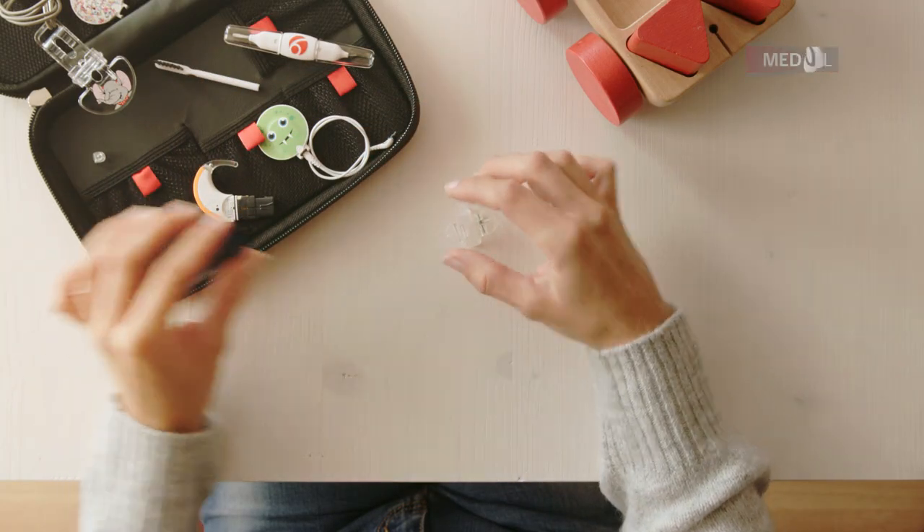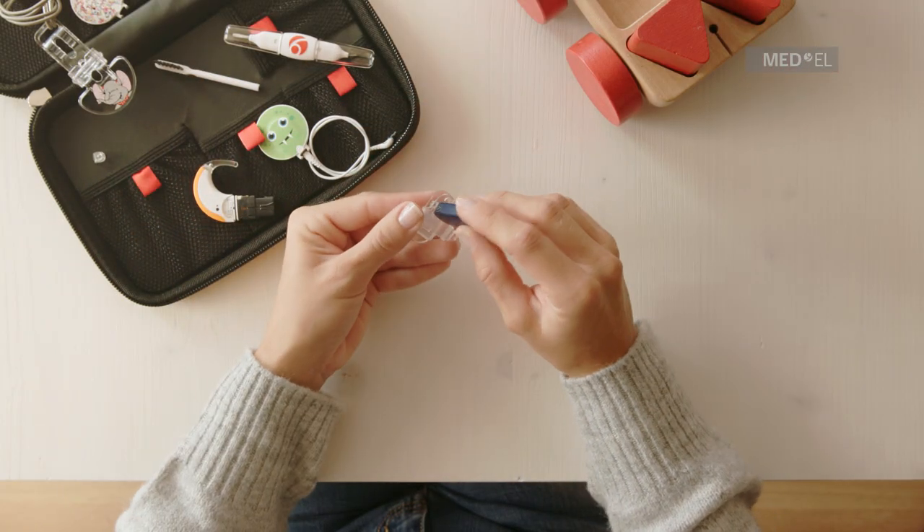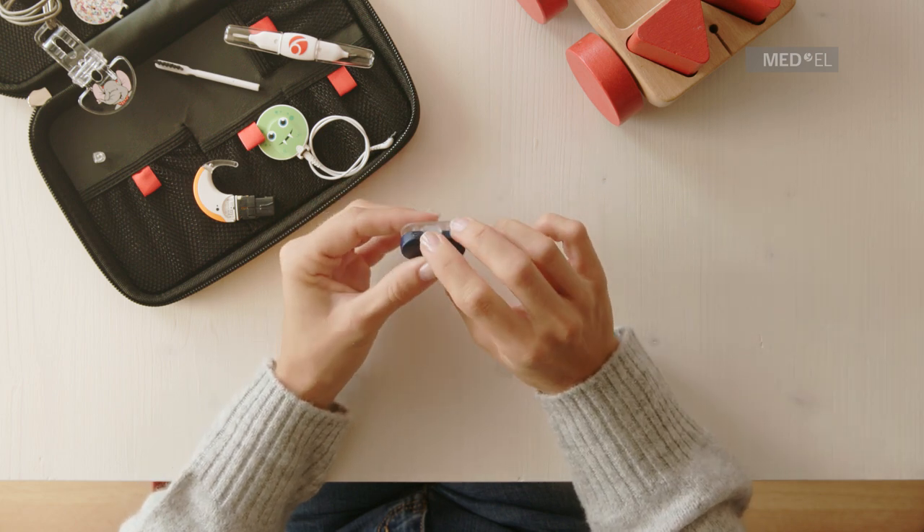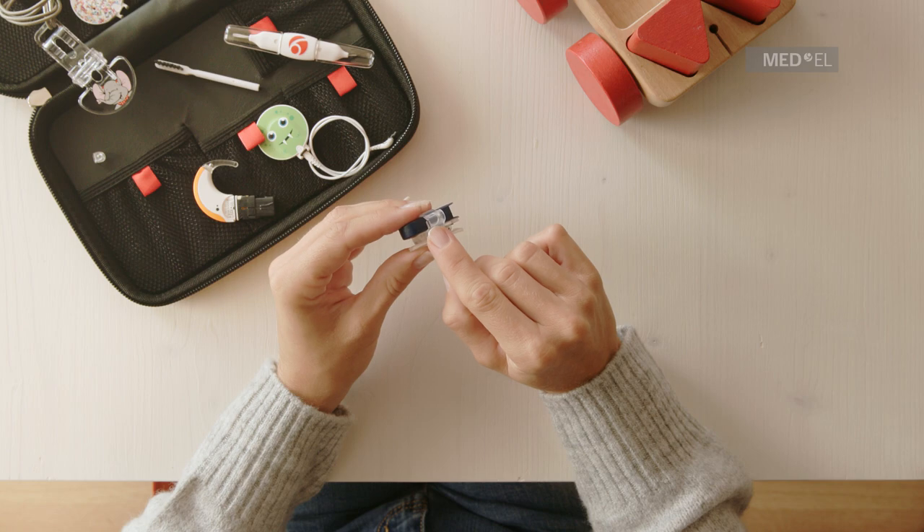To attach baby wear to Sonnet 2, first slide the silicone ring of the attachment clip over the battery pack cover with the small cable ring to the back.